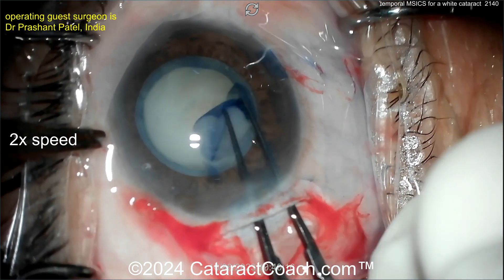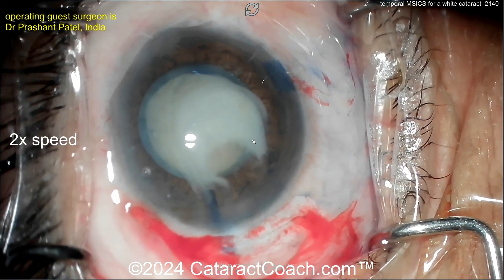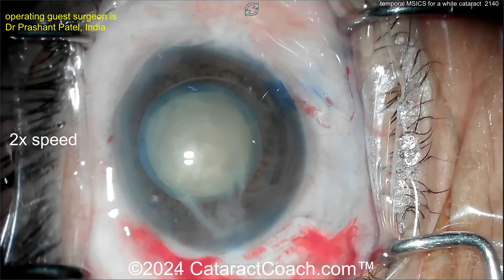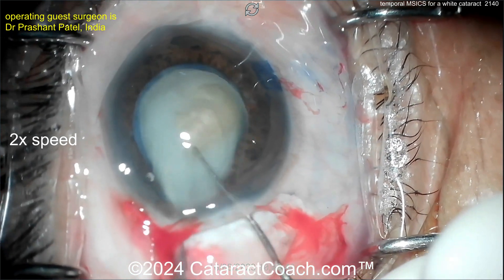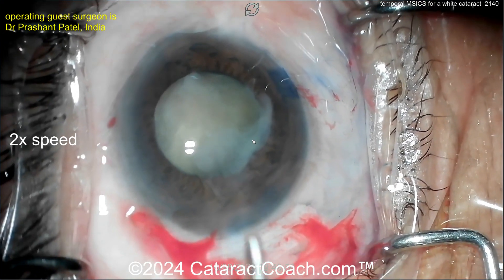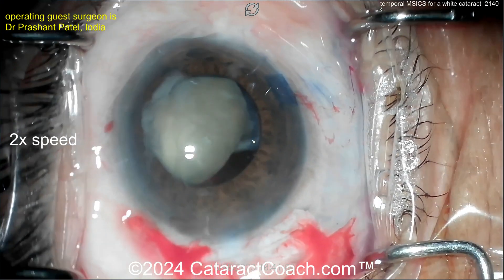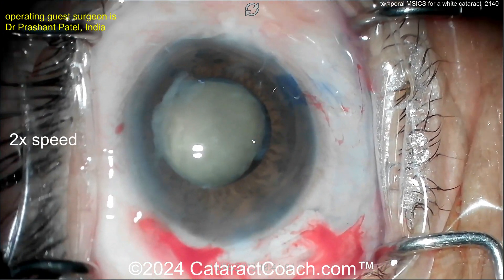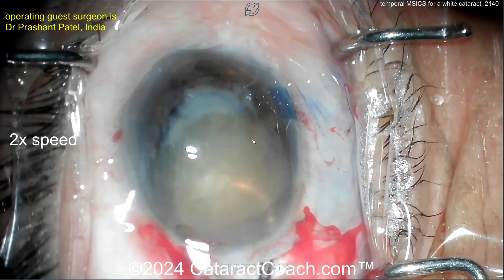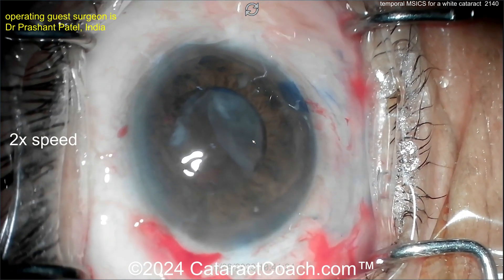With MSICS, don't make a baby rexis — don't make a four-millimeter capsulorhexis. How are you going to get the nucleus out of the bag? Here's a nice generous five-plus millimeter capsulorhexis. Lots of lens milk — this lens will come up very easily. Use some hydrodissection to get the lens out of the bag, use a chopper. Dialing the lens nucleus around, get it dialed up, put viscoelastic behind it — the viscoelastic protecting the cornea too. There's your whole nucleus. Now using a lens loop or lens vectus, going inside to get that lens out and delivered. Beautiful.